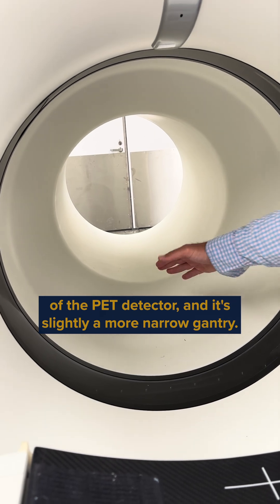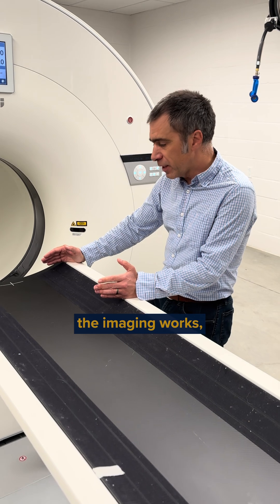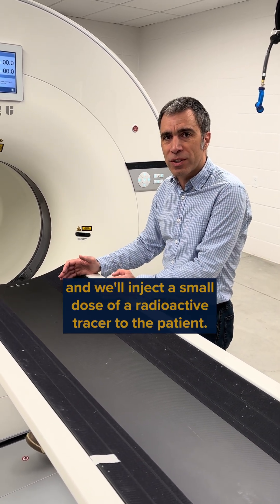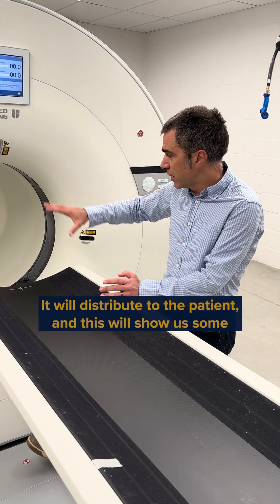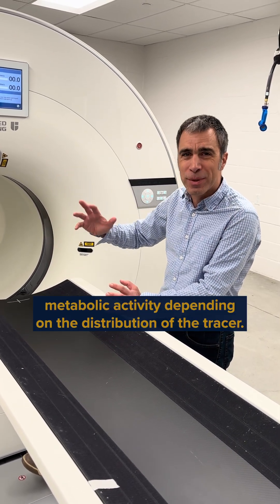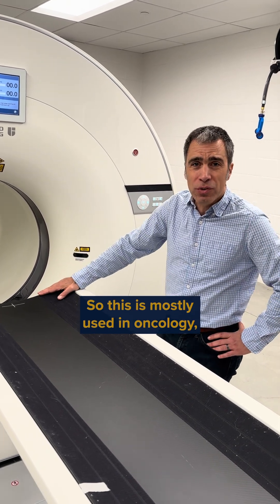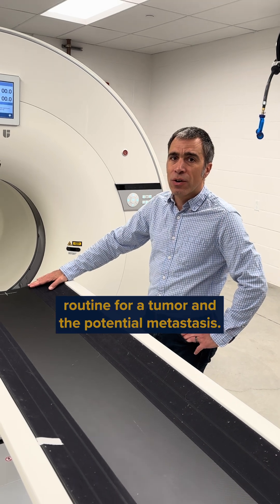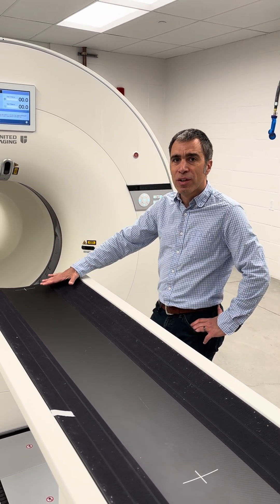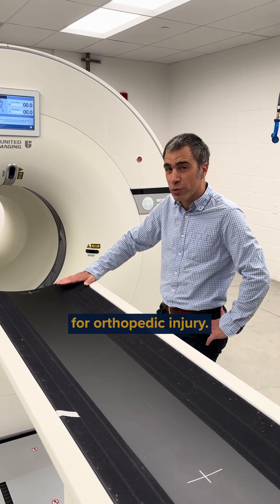It's slightly a more narrow gantry, but for the PET part, we will inject a small dose of a radioactive tracer to the patient. It will distribute through the patient, and this will show us some metabolic activity depending on the distribution of the tracer. This is mostly used in oncology — looking for tumors and potential metastasis — but we also have quite some work using it for orthopedic injury.